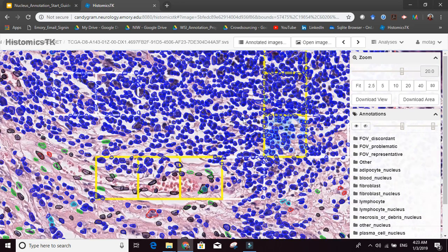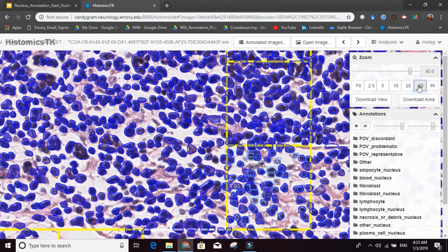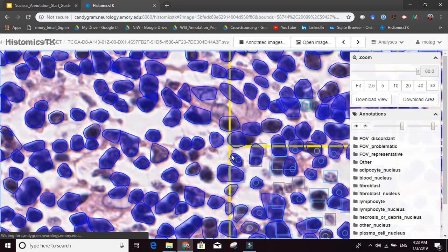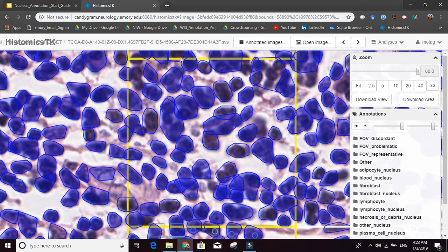So anyways, let's do one field of view for Rukaya. Again, let's do it at maximum magnification. Now you can see the transparency is very, very high. You can't really see the underlying cells. So let's reduce this to almost a minimum, okay? Actually, I like to reduce it to 0. But you may have different preferences. Maybe you want it a little bit higher than 0.